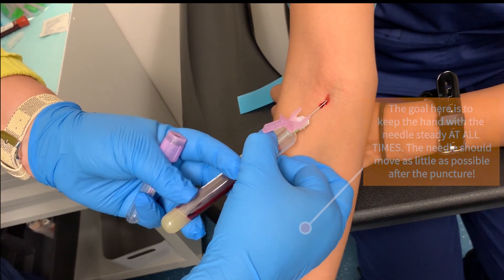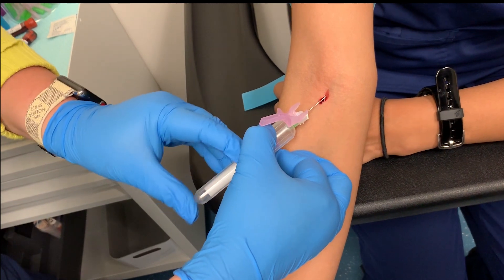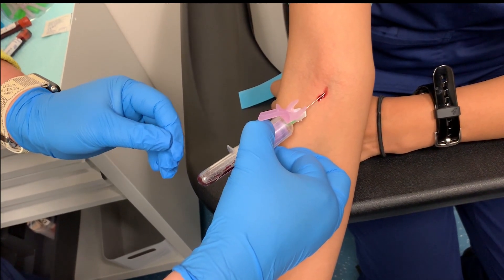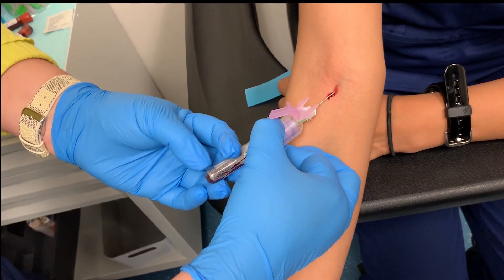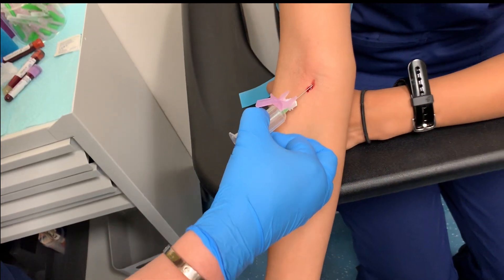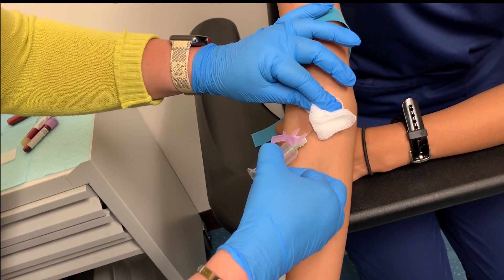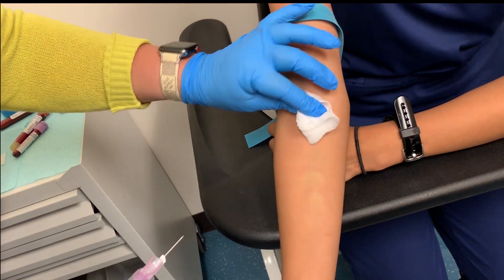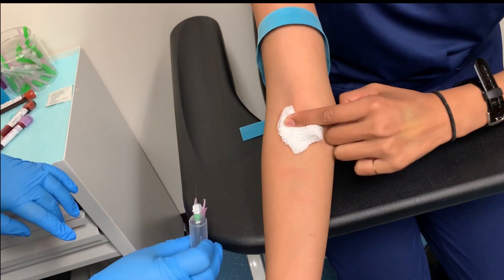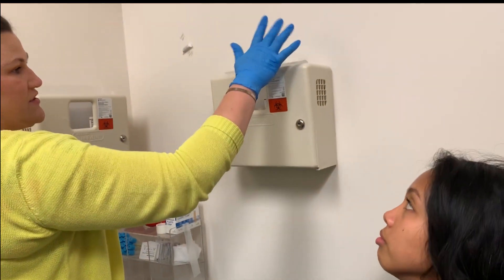I'm going to take some blood in each of those tubes. Make sure you draw your tubes in the correct order. When you're done, take all the tubes off, pull out then down. Have the patient push that down and hold pressure on it. Put your guard up over your needle and straight into the sharps container.